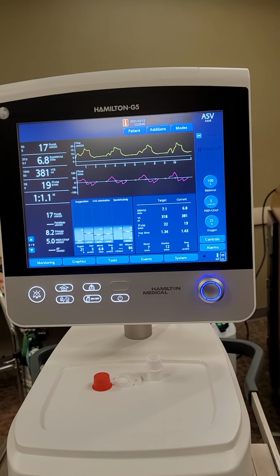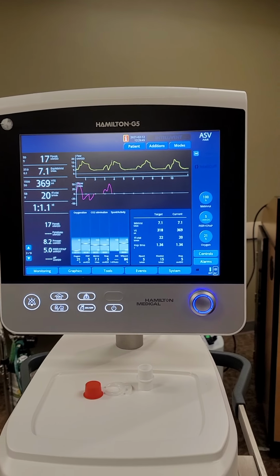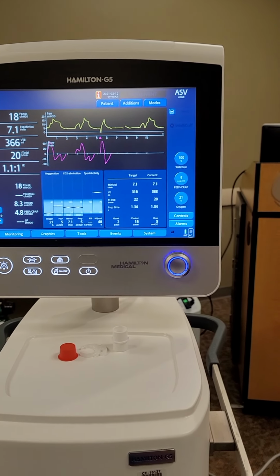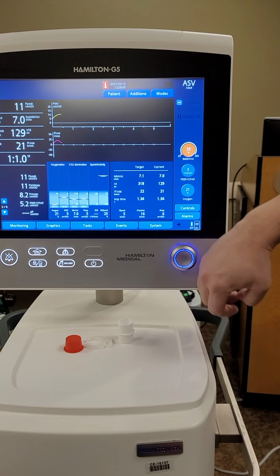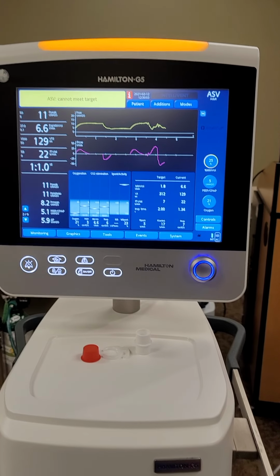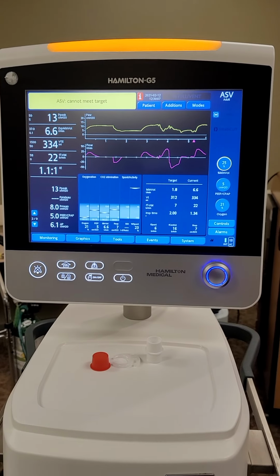I like how you showed the minute ventilation. You want to match that. Is there any number that people should be concerned about going above, 170%, 200%? No. I didn't think so, because you're matching their minute ventilation. If you want to absolutely make sure they're in an SBT, this is 5 over 5. 25% is because 5 is the minimum pressure it's always going to give. Huh. It's cool. Good to know.